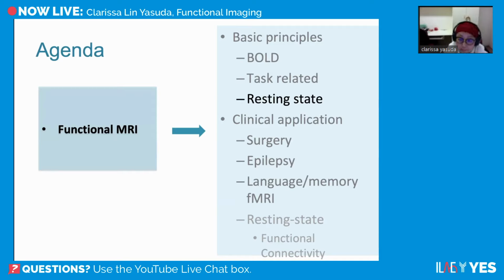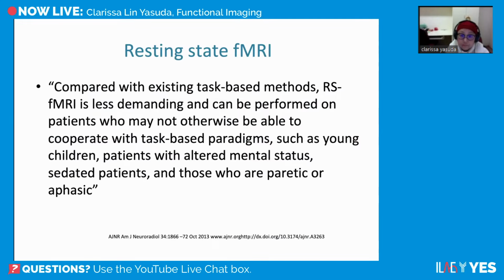Okay. So this last bit, I will talk about the resting state. I think it is very popular, and I want to talk a little bit about the resting state and some clinical applications as well. So different from the task-related fMRI, the resting state, of course, is acquired at rest, so the subject does not need to do anything.